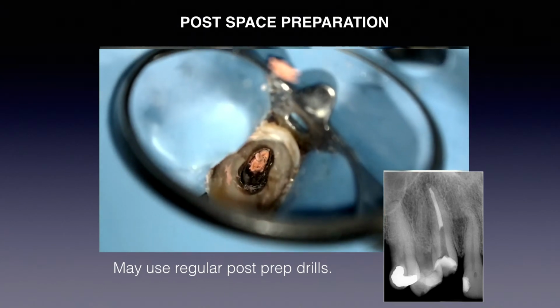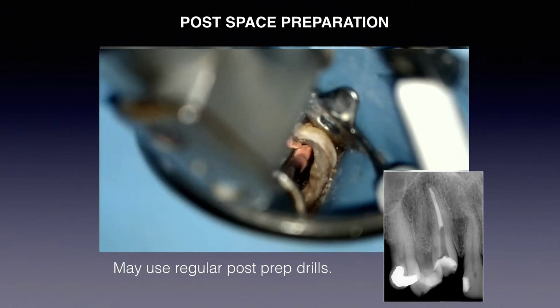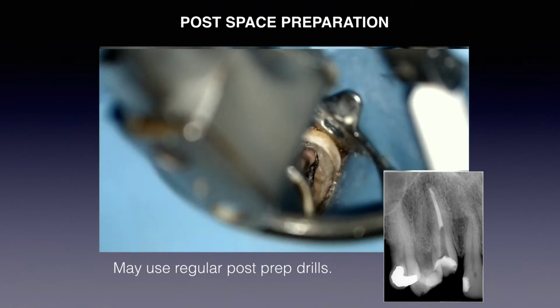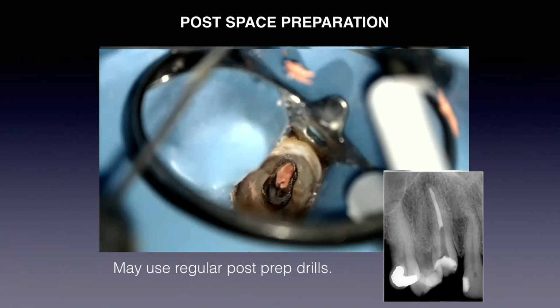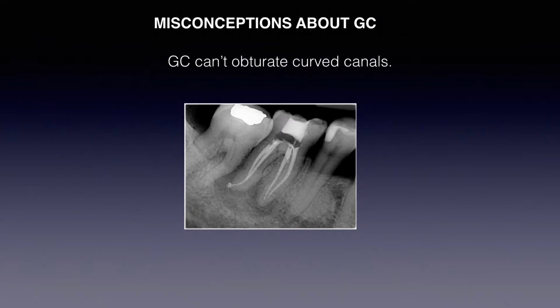So again, it's another one of those comments that's thrown out there that I just don't understand. Oh, you can't retreat it, or you can't do a post-space. Well, then that means you can't do the same things for Guttapercha obturations. And then it brings me to this. Well, you can't use it on curved canals. Actually, this is probably the best system for curved canals because it is warm from the tip of the GuttaCore all the way to the CEJ area.